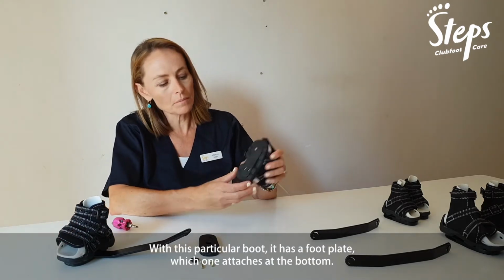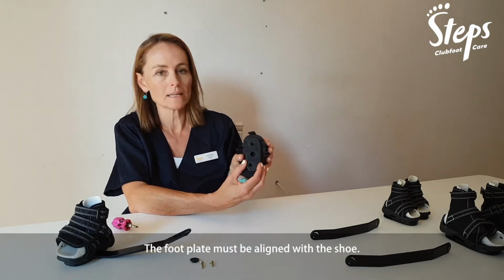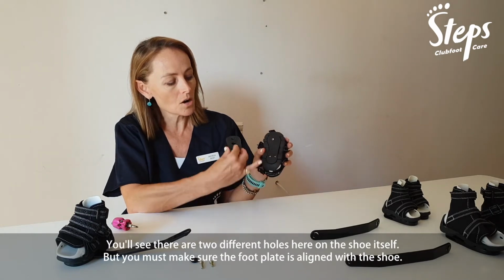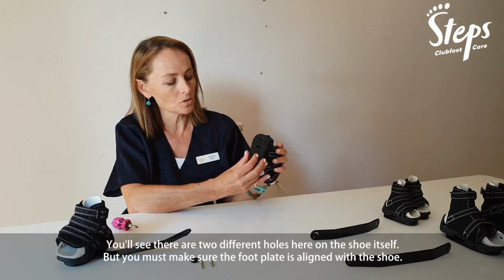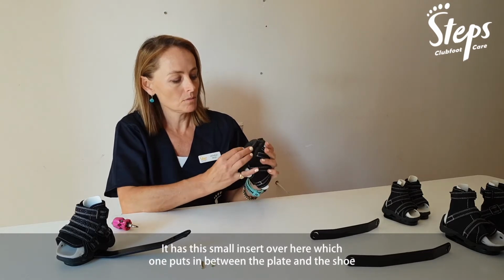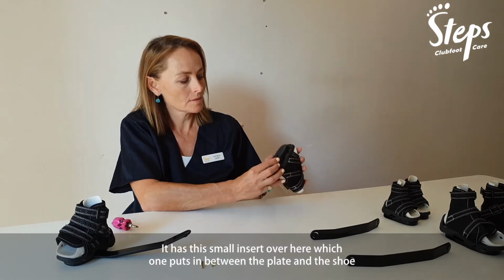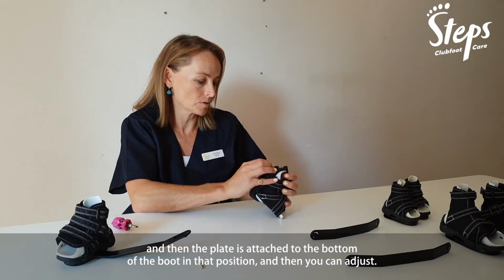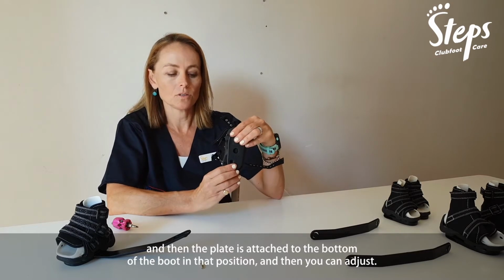With this particular boot, it has a foot plate, which one attaches at the bottom. The foot plate must be aligned with the shoe. You'll see there are two different holes here on the shoe itself, but you must make sure that the foot plate is aligned with the shoe. It has this small insert over here, which one puts in between the plate and the shoe. And then the plate is attached to the bottom of the boot in that position.